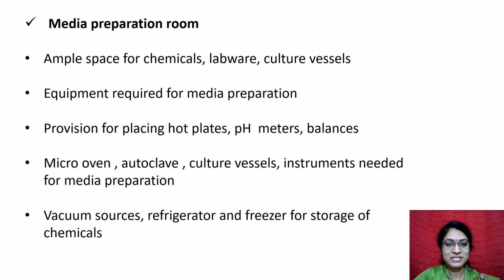Vacuum sources, and a refrigerator and freezer for storage of chemicals which would get spoiled at room temperature, must also be present.